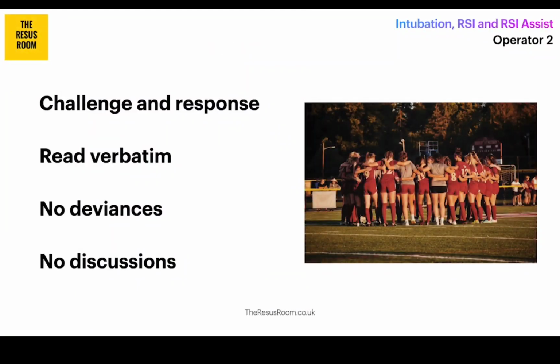Now, the final step of preparation is getting the team ready and drawing everything together with a checklist. And this has got to be undertaken just prior to induction of anaesthesia, once everything is laid out and ready. It is called a checklist, after all, and not a do list. So I don't really think it matters who reads out the checklist. In reality, it's probably going to be Operator 2, because as we've said, Operator 1 might have their hands full with airway management. But I say it doesn't matter, because this should be a challenge and response checklist with both operators involved. And the checklist should be read out verbatim with no deviances, because each item should be a positive statement to which the answer is check or present.